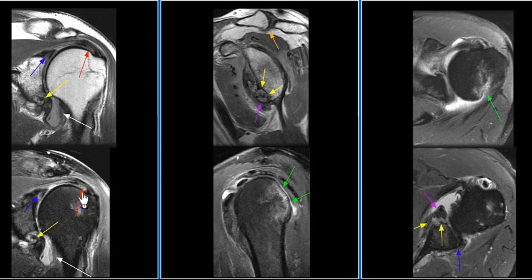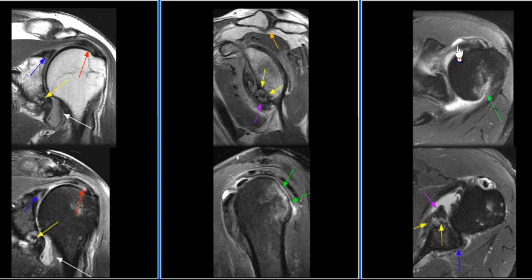There is fraying of the articular surface of the distal supraspinatus tendon and subscapularis tendinosis.